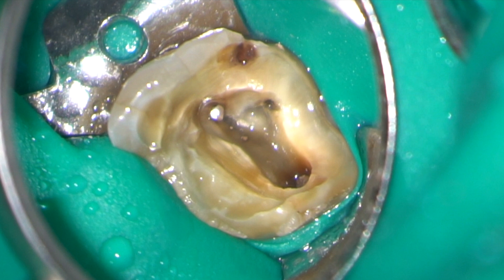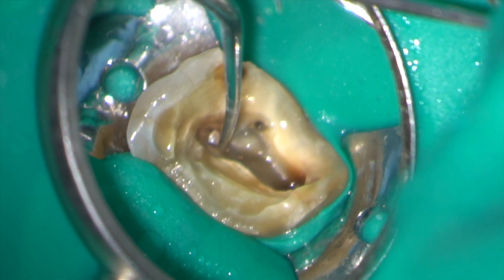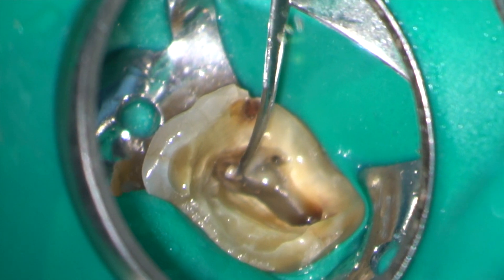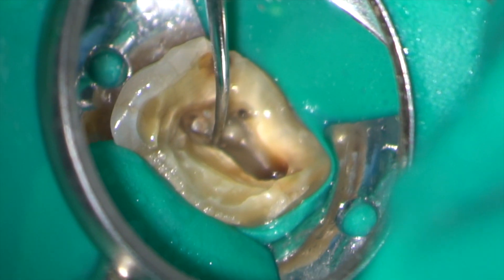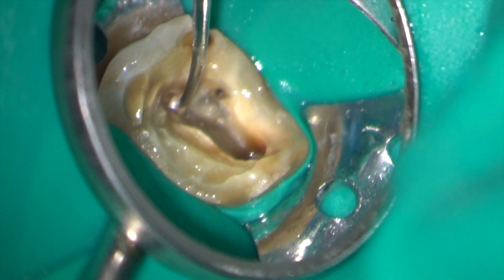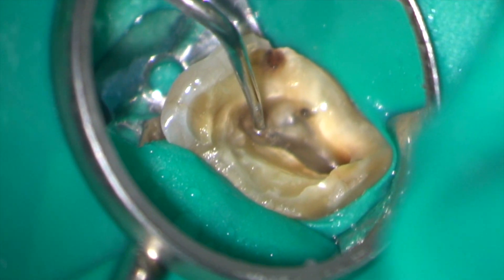The floor of the pulp chamber has now been cleared and you can see that the silver point is flushed. There's nothing to grab with tweezers or Steiglitz forceps.